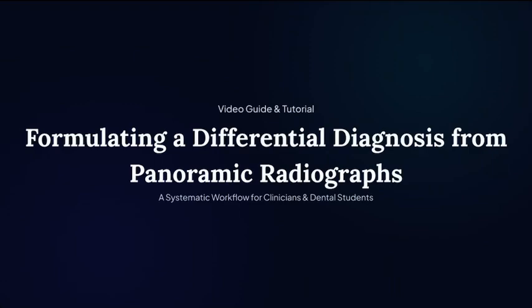Hello, let's start the first video on our YouTube channel with a frequently asked question about how to formulate a differential diagnosis from the panoramic radiograph. It will be a systematic workflow for clinicians and dental students.